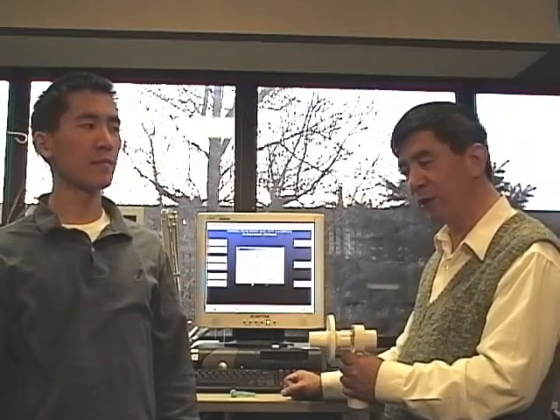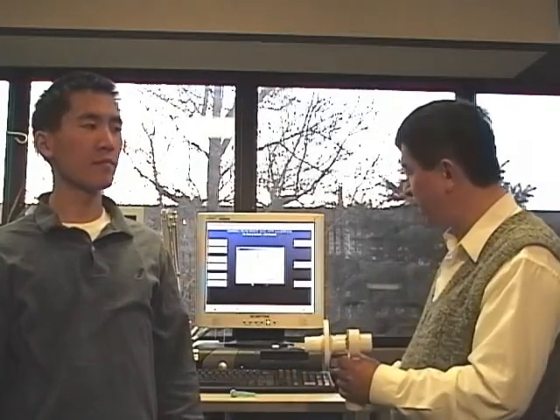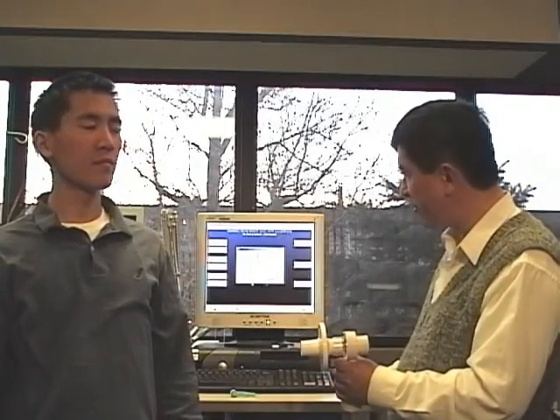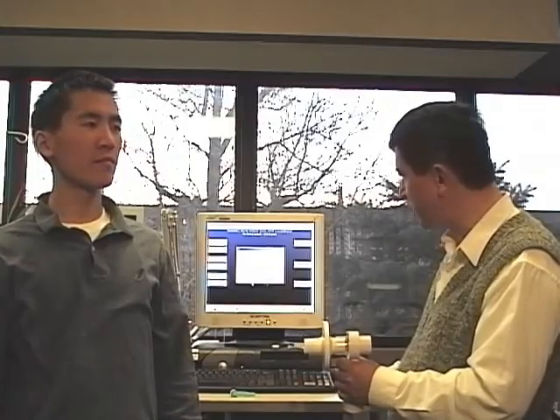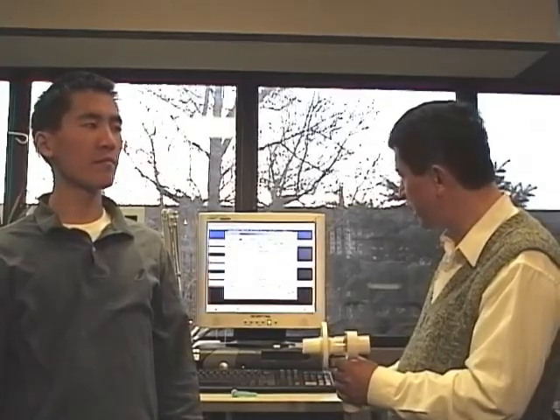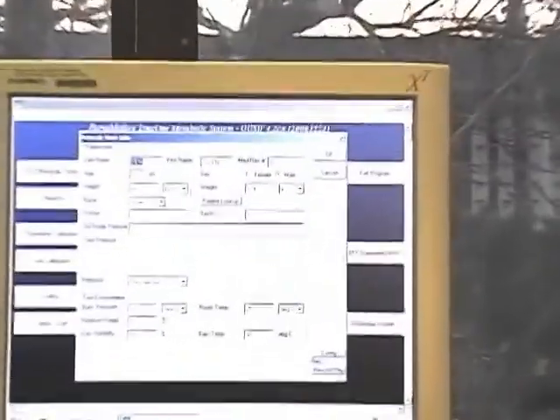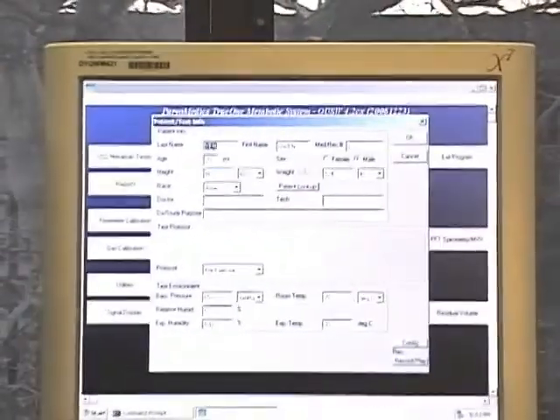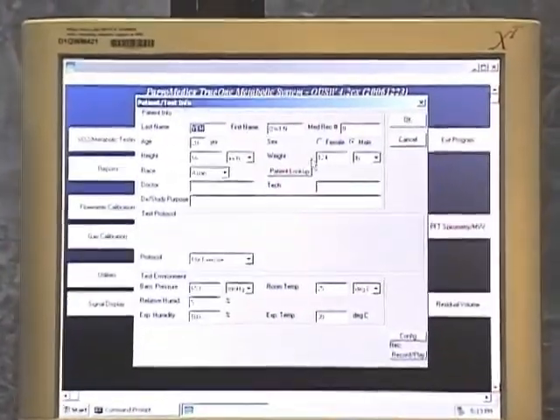Now we are going to start the MVV demonstration. MVV — maximum voluntary ventilation. You click the button, then pull out the information of the patient or subject.